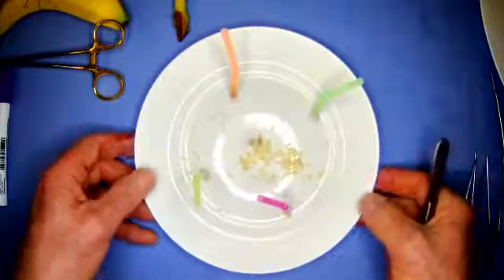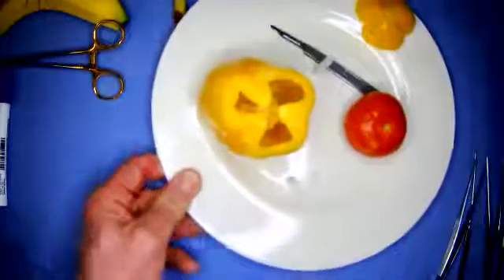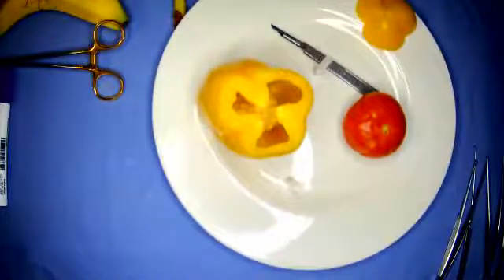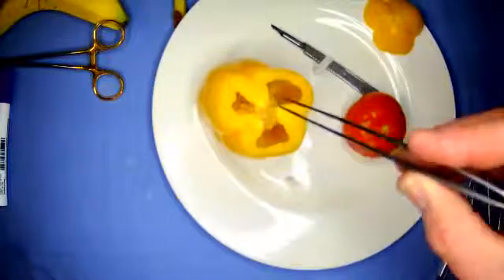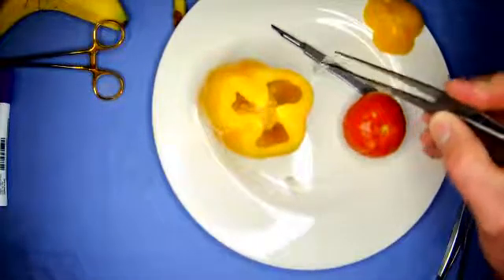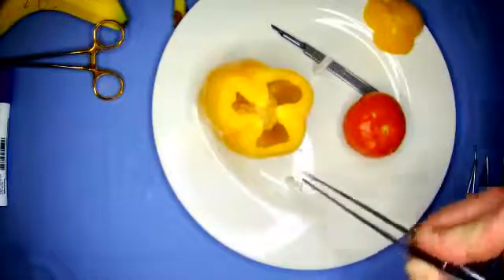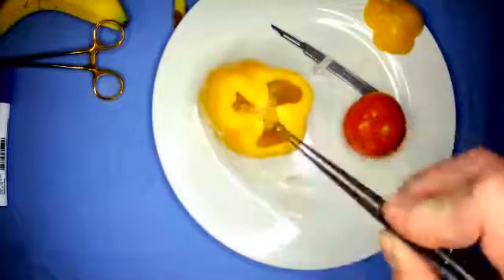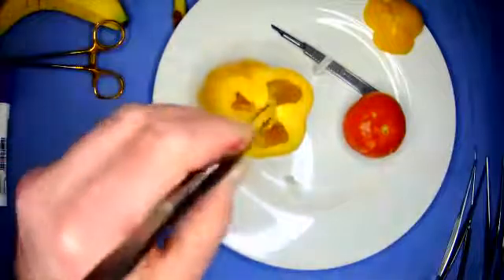So, extending this accuracy, I've been thinking of how to practice at home. I wondered what other things I could use. And I've taken the top off a pepper here. And inside the pepper, you can see there are lots of little pips. And I'm reaching into a cavity. I'm going to pick up these pips from the inside and adding to complexity, dropping them into the end of the rice.